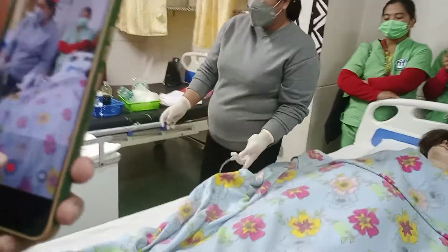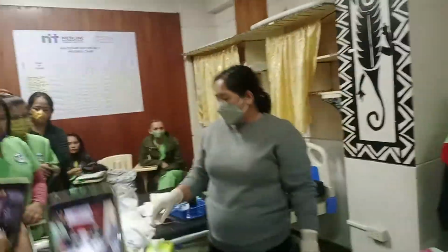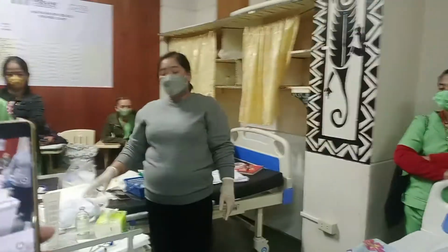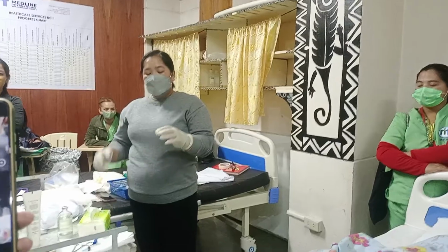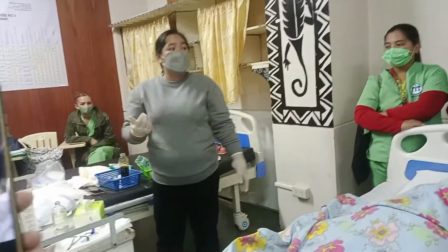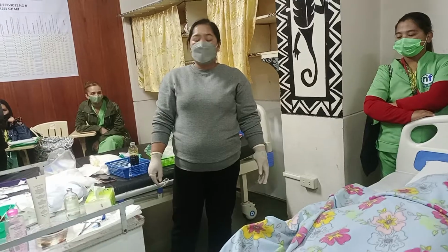So I will go to my patient. Ano ang mga dala-dala ko? Pwedeng meron kayong wet wipes or tissue. And then, you have your underpad kung necessary, but not all the time, no? Kasi okay lang naman. After that, okay na, hindi na siya sterile. You don't have to wear a sterile gloves. Kailangan nyo lang gumamit ng clean gloves to protect you from the secretions coming from the patient.